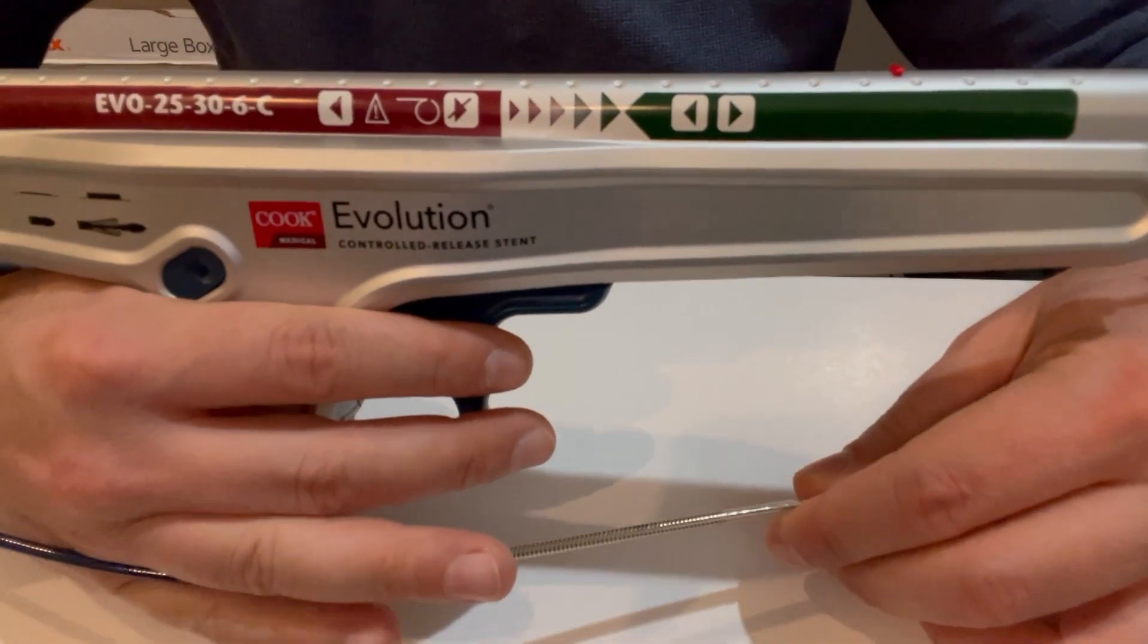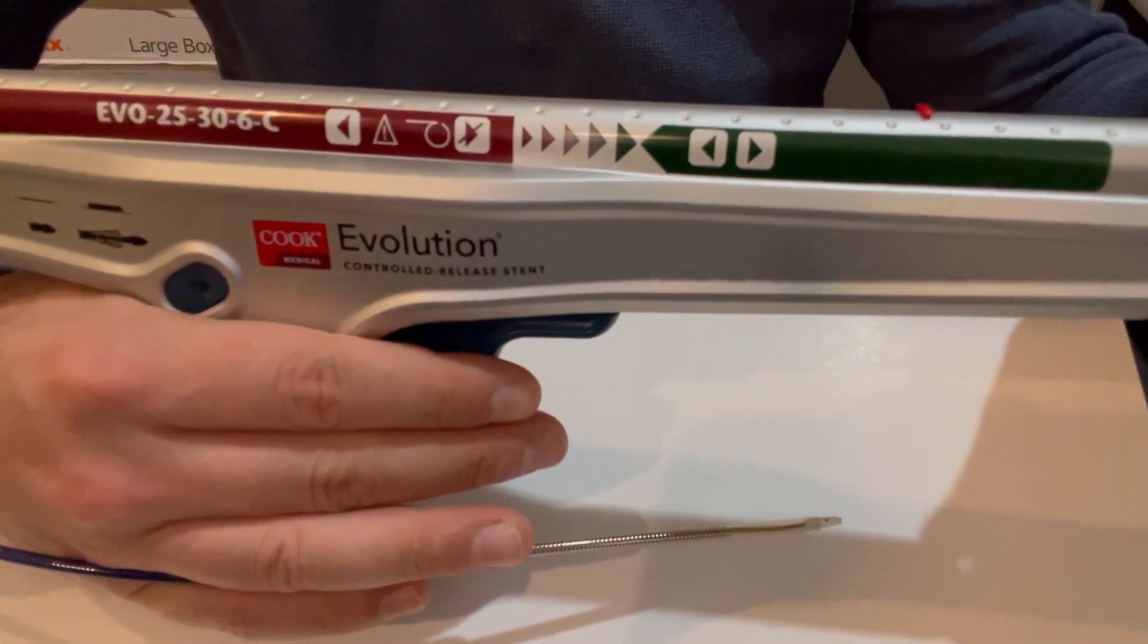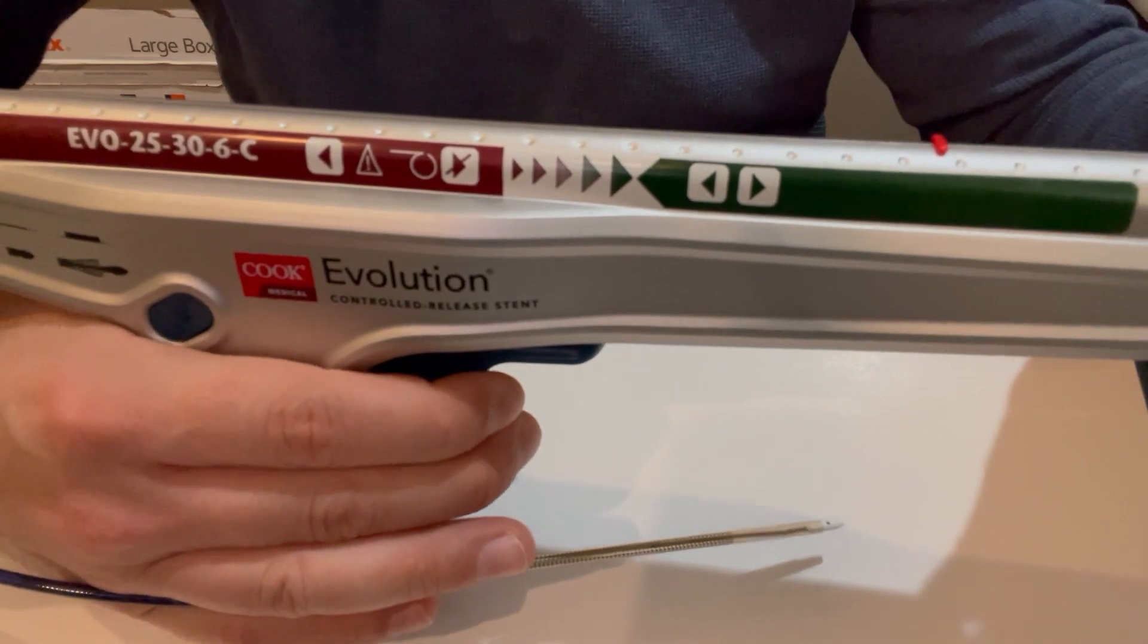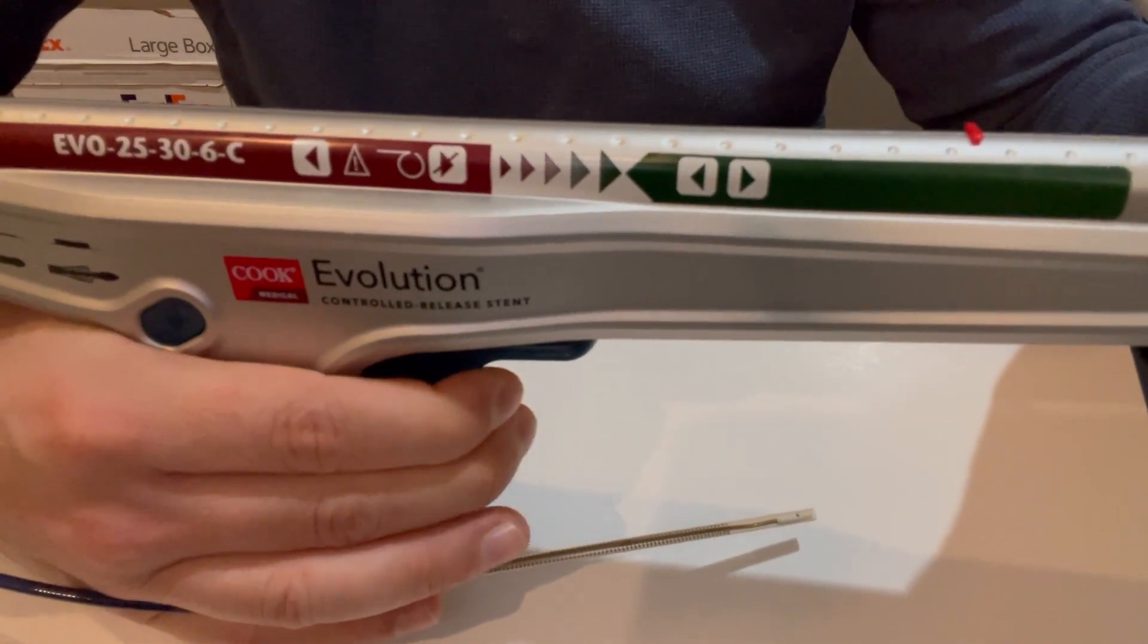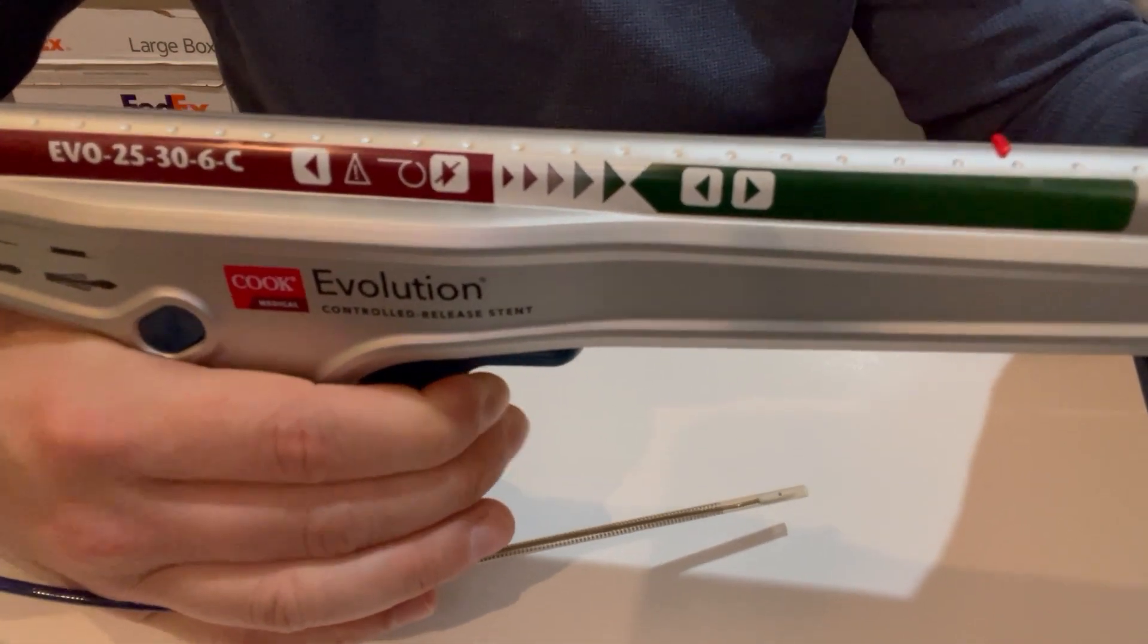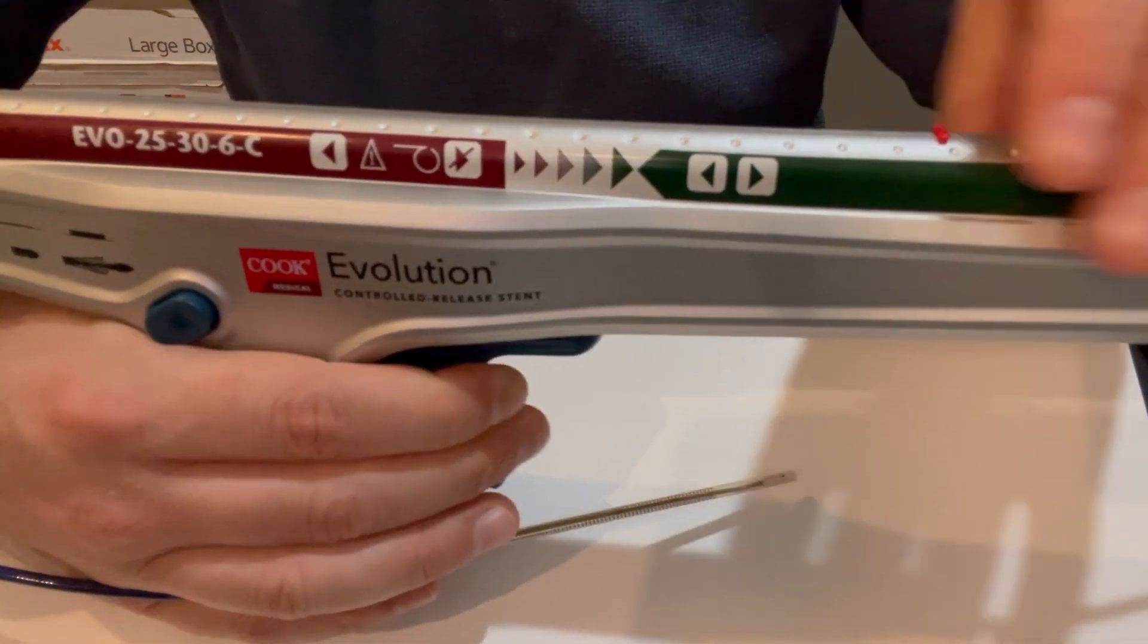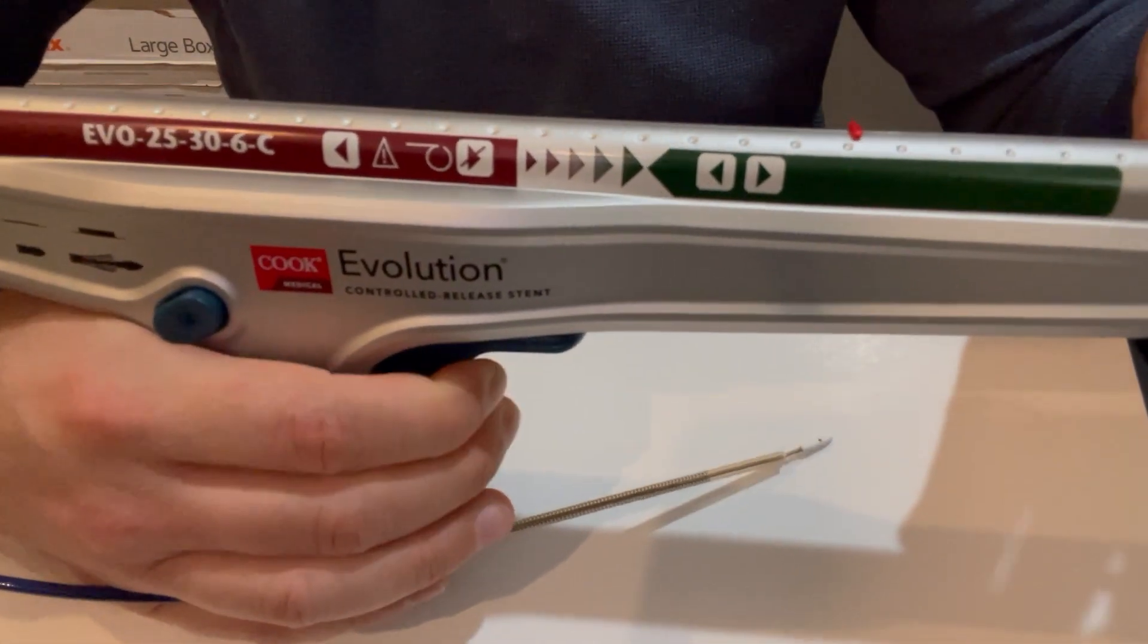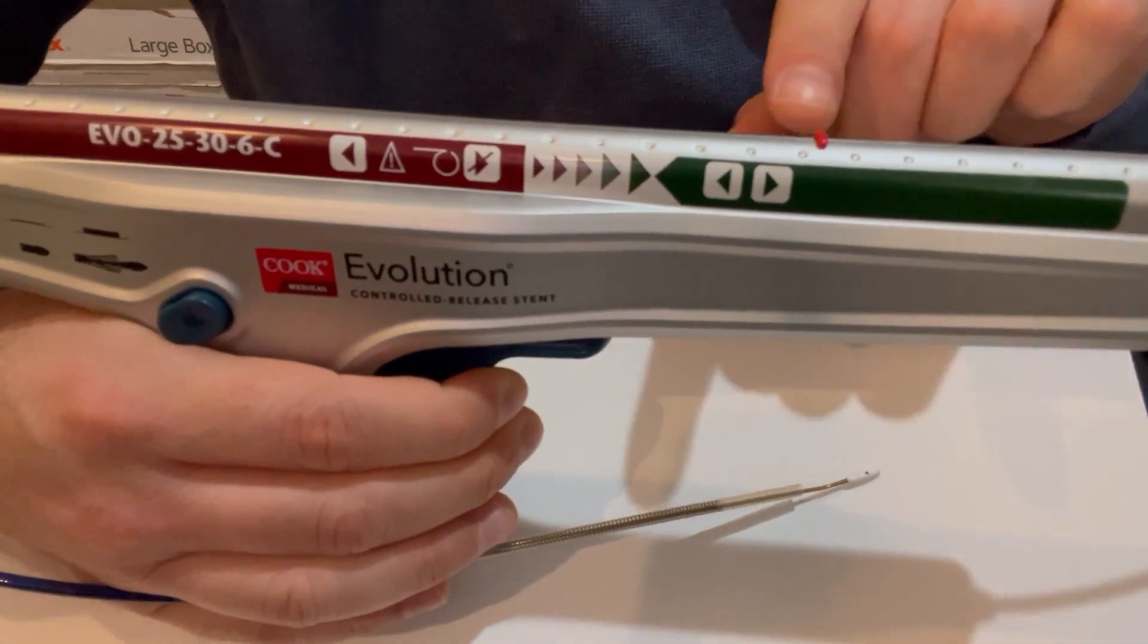But the reason I really like this system is its flexibility. As you can see here, when you pull the trigger, you can deploy the stent. It's a self-expanding system.